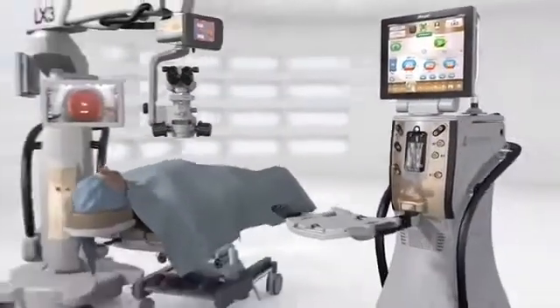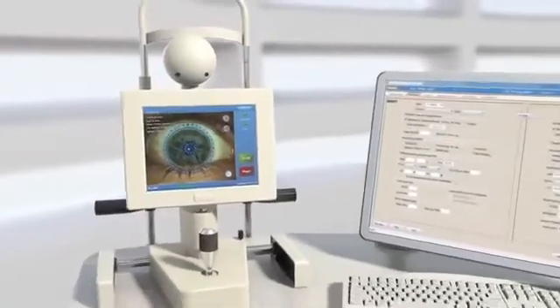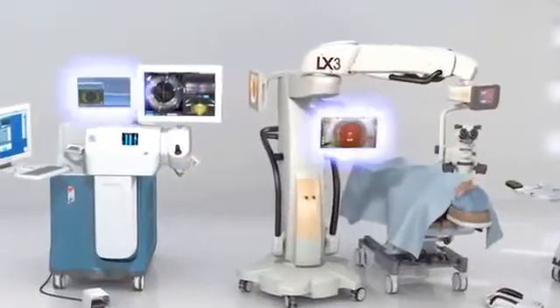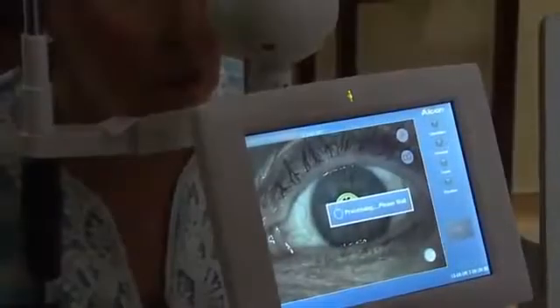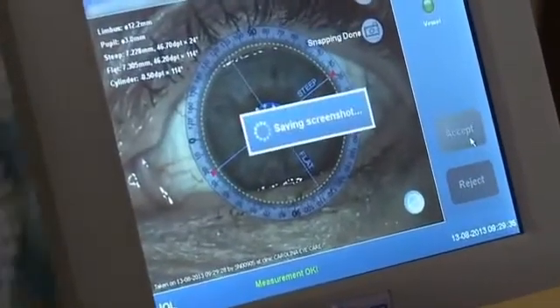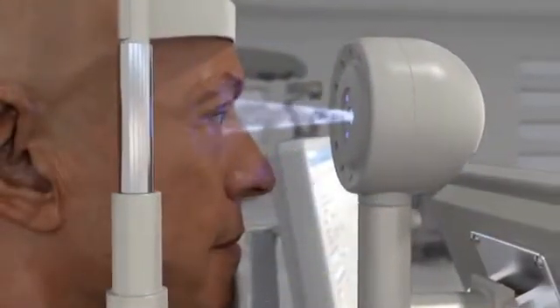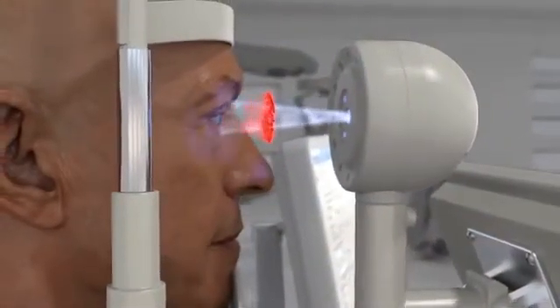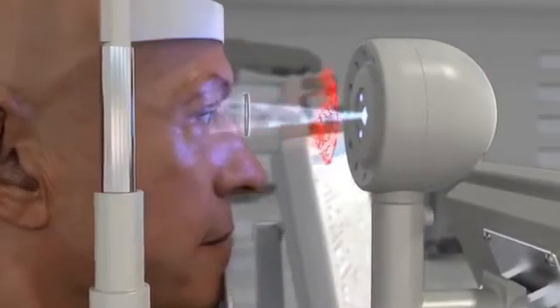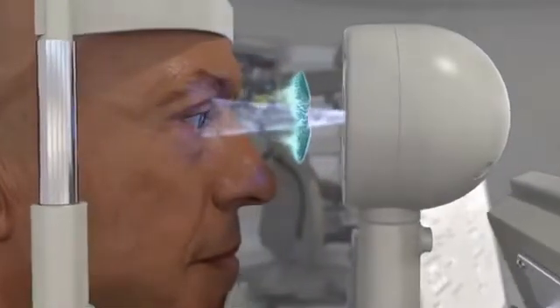The Verion Image Guided System consists of the Verion Reference Unit and the Verion Digital Marker. The Verion Reference Unit performs key diagnostic measurements and captures a high-resolution image of the eye in a single step. The high-resolution digital image of the patient's eye captures scleral vessels, limbus, and iris features.